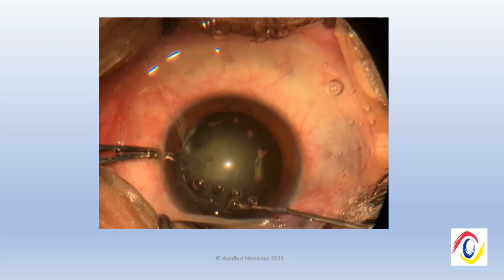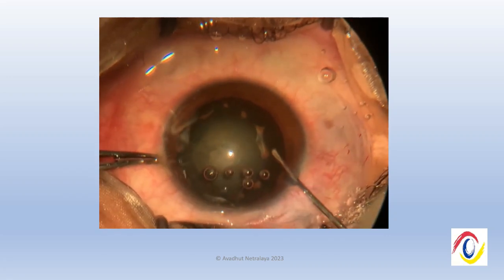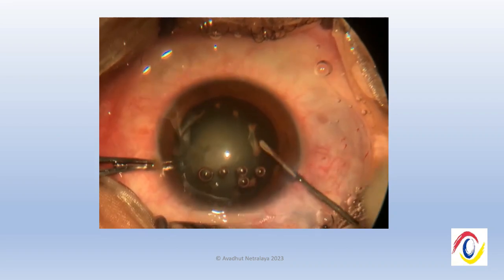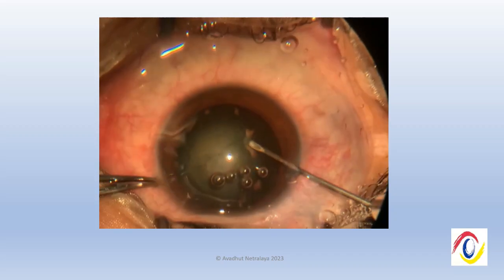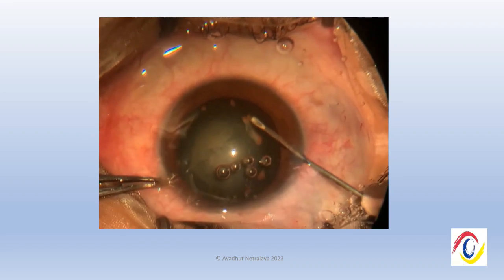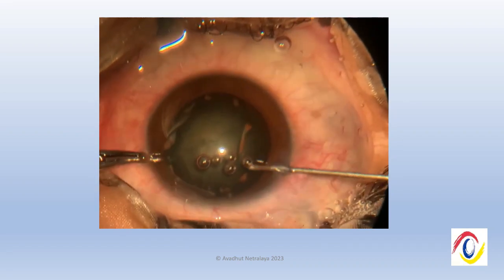So we decided to do a can-opener capsulotomy, including all the iron deposits on the anterior lens capsule, so that we could get rid of them as well. Most of the deposits, especially the larger ones, were included.